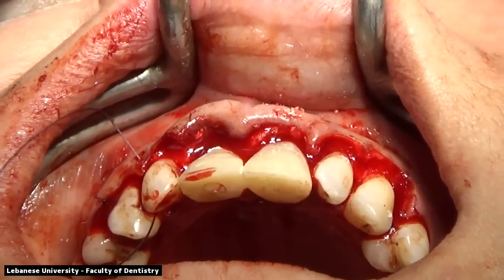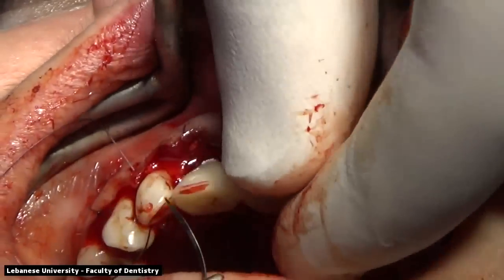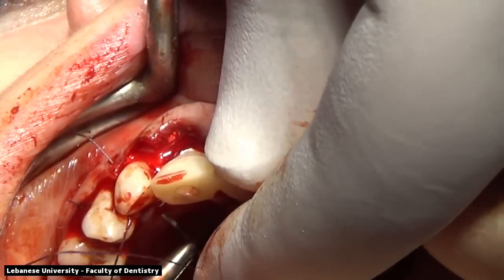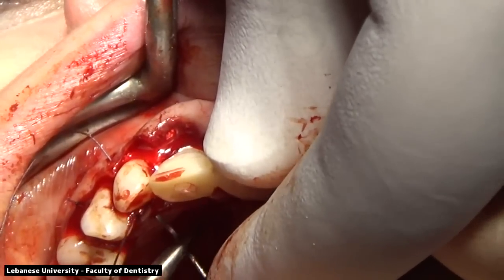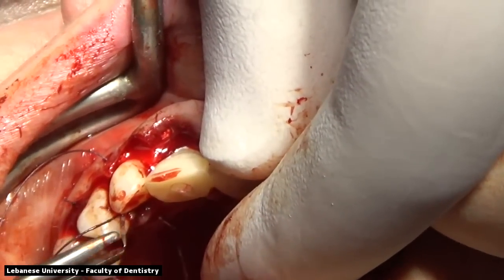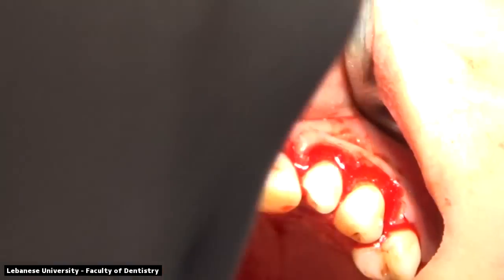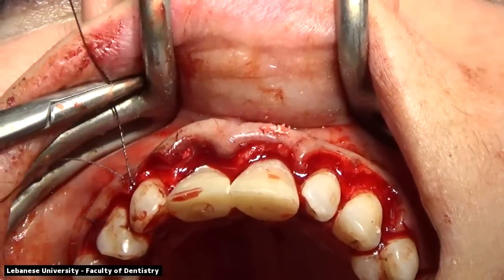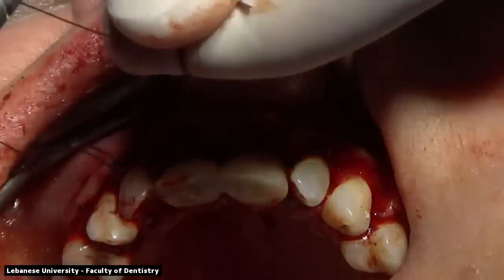So with the diagnosis process, noticing that the two lateral and canines needed crown lengthening prior to the implant would help with the gingival profile and the gingival levels and give the patient a more aesthetic smile. The other thing that we should notice is to always adjust the bone levels on the neighboring teeth before doing your implants, because in this case we needed to check the buccal, the crest of bone on the buccal.